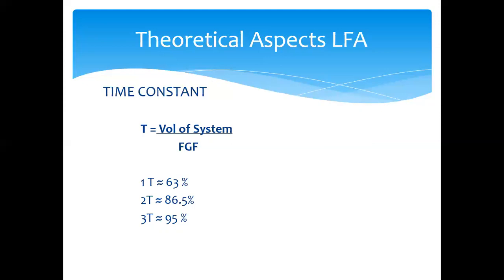Practically, think about it this way. Let us say the patient is starting to have some amount of hypertensive response, or the patient is showing some tachycardia, or the BIS numbers are not to my liking, and to increase the depth of anesthesia, I am changing the concentration of the agent from 2.5% to 3.5%. It will take 18 minutes for those changes to occur. And this is a time lag which obviously is too long and not acceptable, when I'm using a fresh gas flow of 1 liter.